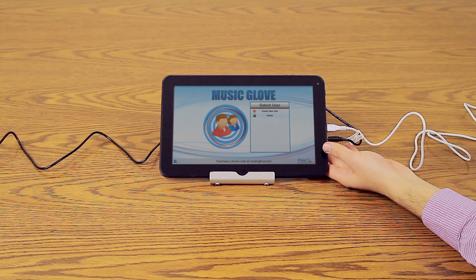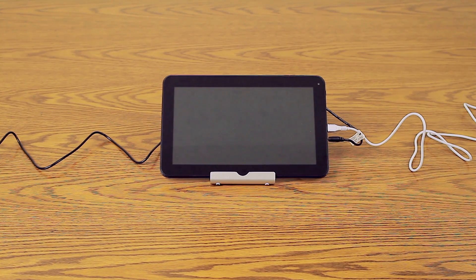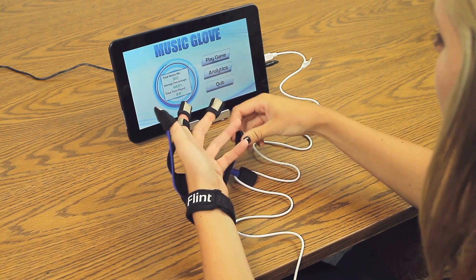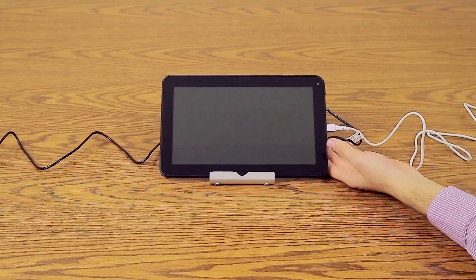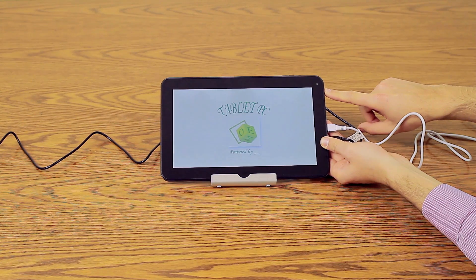You may turn off the screen on the tablet at any time by tapping the Power button on the top right of the device. Tapping the Power button again will turn the screen back on. If you stop using the tablet, the screen will turn off automatically after 30 seconds to preserve battery life. Simply tap the Power button to turn the screen back on. Holding the Power button down for 3 seconds will shut down the tablet completely.